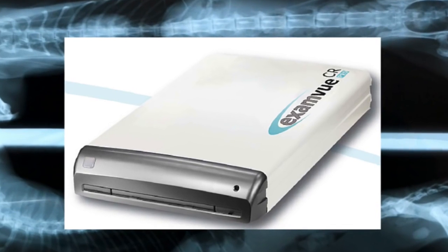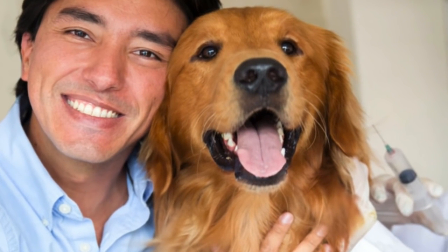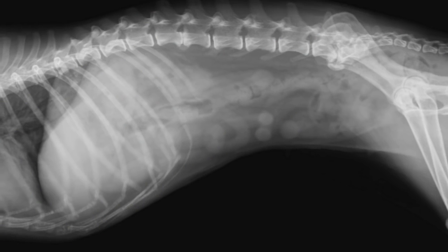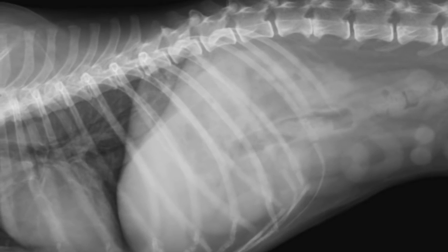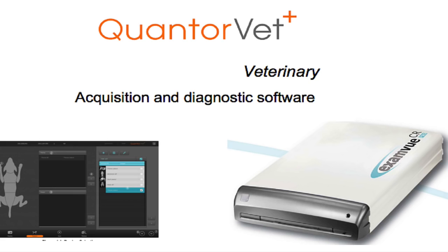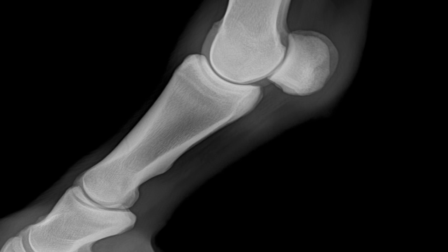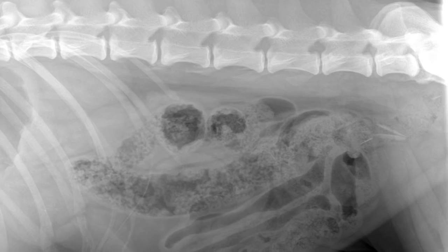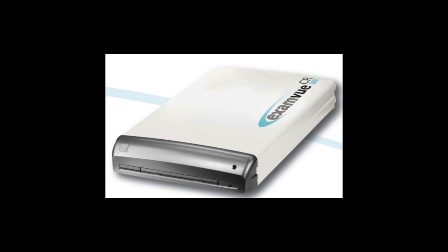Quality technology and competitive pricing are the best words to describe the Examvue CR Pro. Amazing next-generation technology that works together and is easy to set up and use in any veterinary clinic. Examvue CR Pro and the QuantorVet imaging software gives you a simple way to manage, optimize, and process your X-ray images. This video is a quick overview of the QuantorVet software used with the Examvue CR Pro.